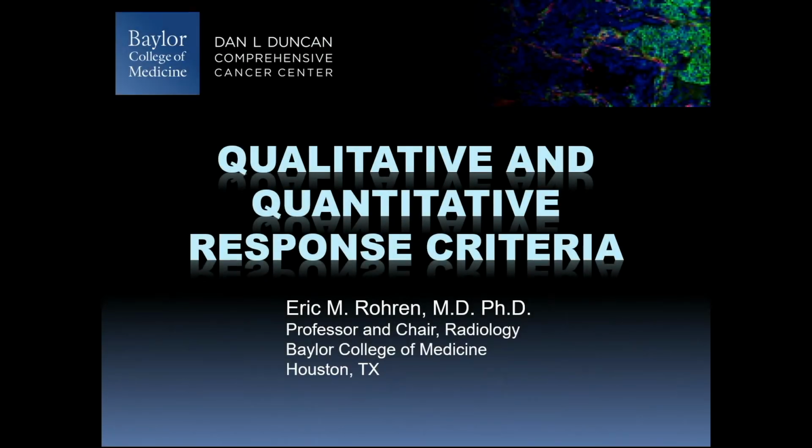So I'm going to be talking to you about response assessment and response criteria using PET imaging. I'll focus a little bit on some of the commonly used schema for response assessment, both qualitative and quantitative. I'll give a little bit of a caveat at the beginning that in clinical practice, I'm clearly a qualitative person. So I want to convey what's happening to the patient, and I'll use descriptive terms, and, when necessary, you can call the clinician and talk to them.